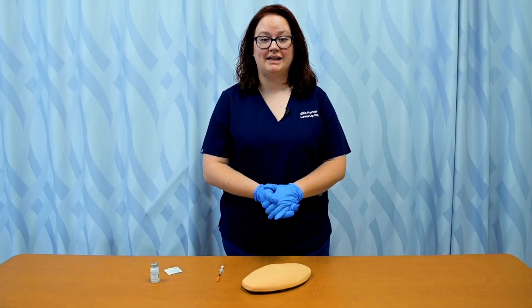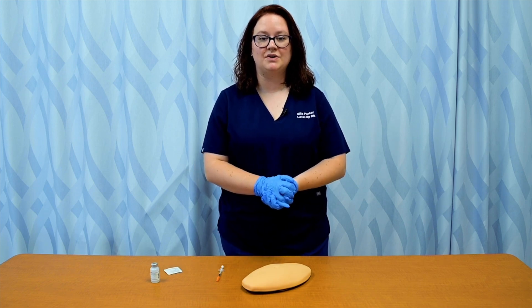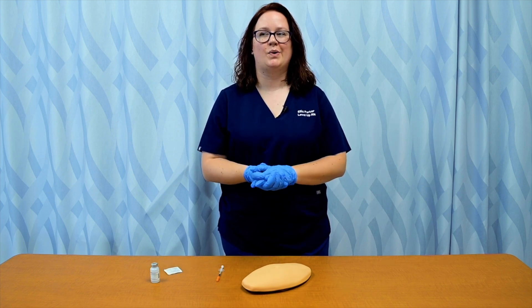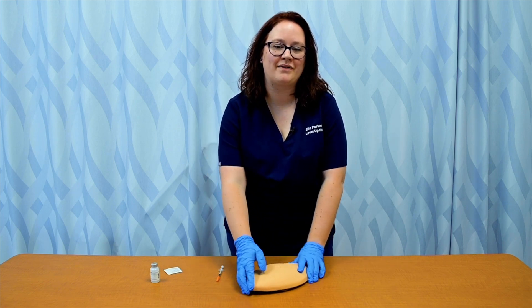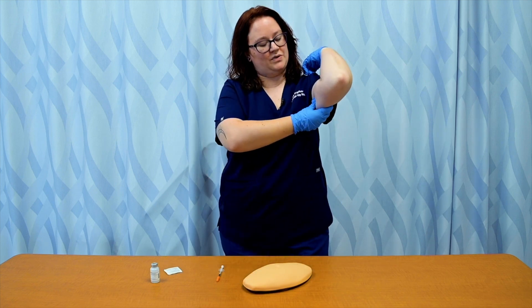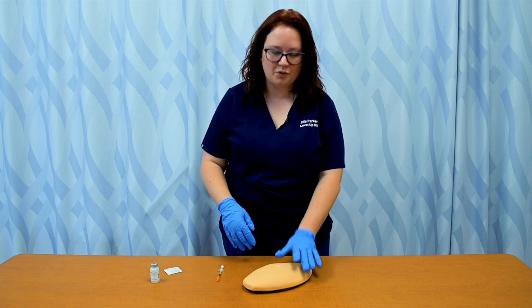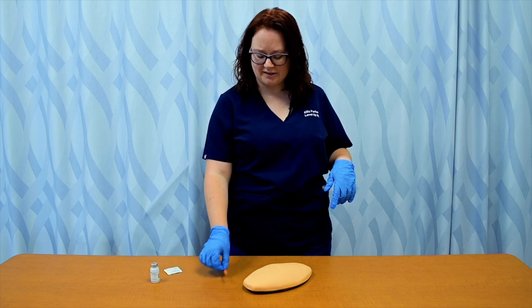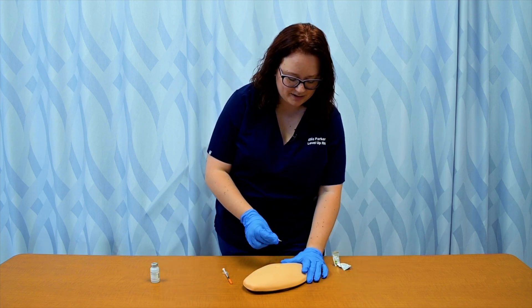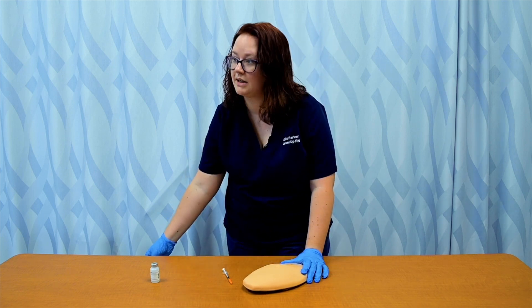In preparing for my subcutaneous injection, I've already done my hand hygiene and donned gloves. I need to select the site I'm going to use — any site that has a surplus of subcutaneous or fatty tissue. The most common areas are your abdomen, the backs of your arms, and the lateral aspects of your thighs. We'll be using the abdomen today. I've already drawn up an insulin needle with some insulin. I'm going to use an antiseptic swab to clean in a circular motion, starting where my injection is and moving outward, and allow that to dry.